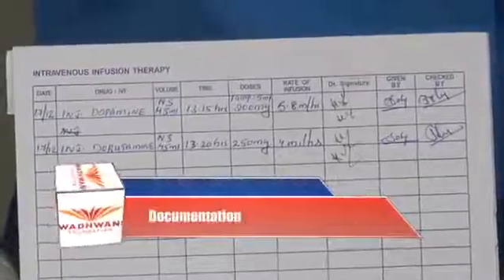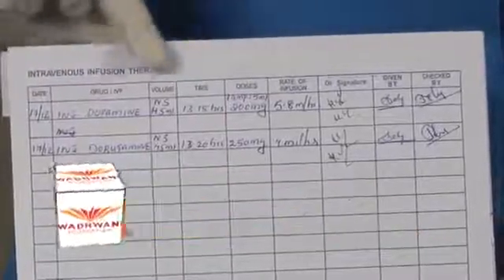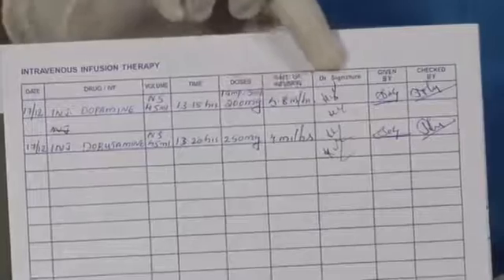Documentation. After starting the infusion, we should document it. This is the chart we follow. This has information in various columns giving details of injection, dilution, time, dosage, rate of flow of infusion, doctor's signature, given by, and checked by. We have now successfully started the administration of the drug to the patient using the syringe pump according to the doctor's orders.